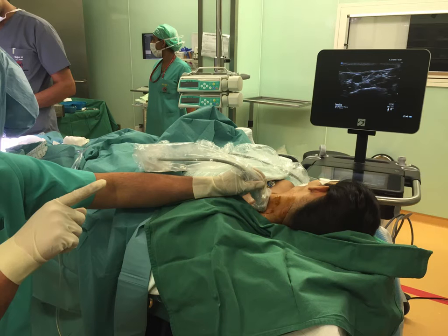How to do it? This is the position of how to do it. What you are seeing on the ultrasound screen is a flat line below the carotid artery. We'll level it, you'll get to know. Probably this is the C7 level.